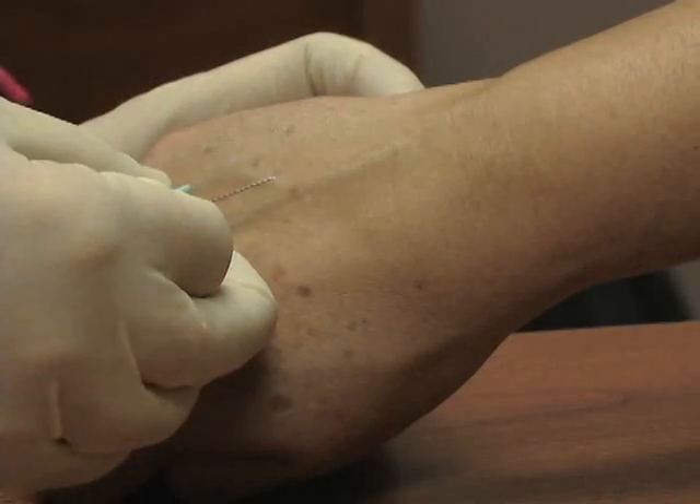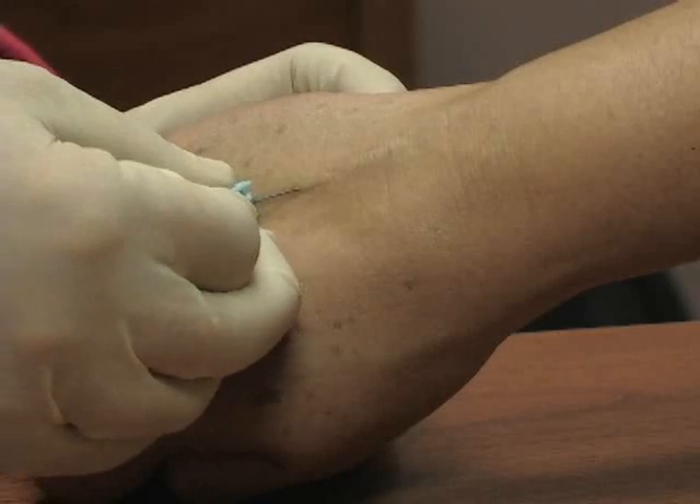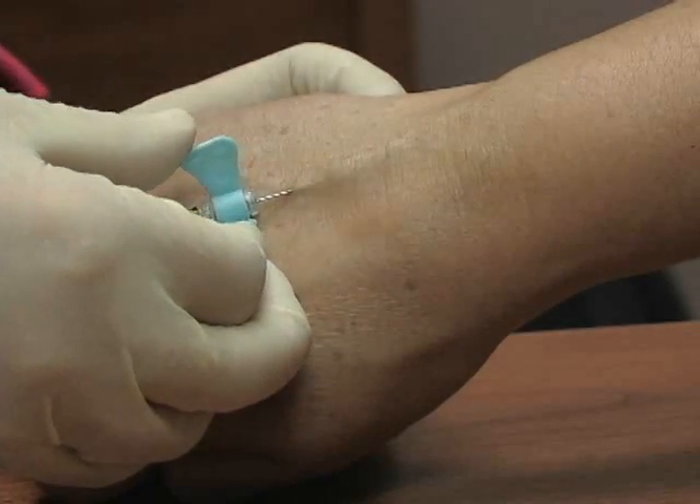I'm going to stabilize the vein and go at it at a shallow angle — one, two, three, in. I get a nice blood return and then I can pop my tube on, and you'll get your blood going right into your tube.